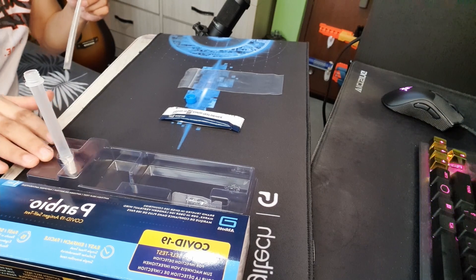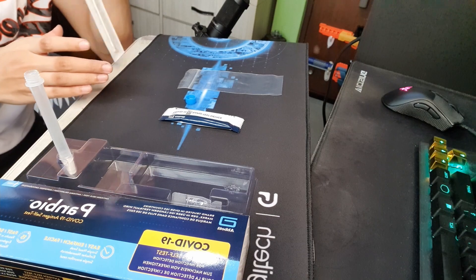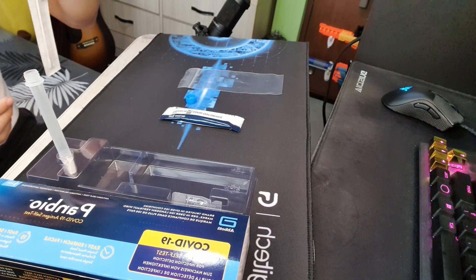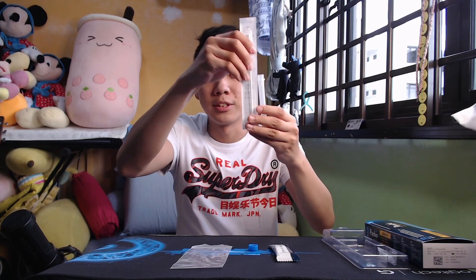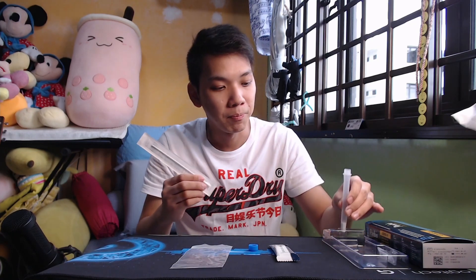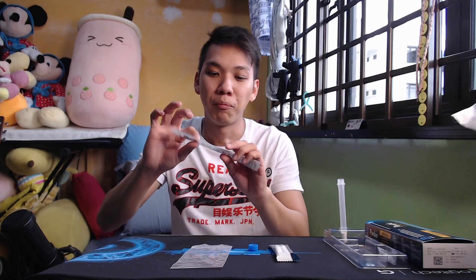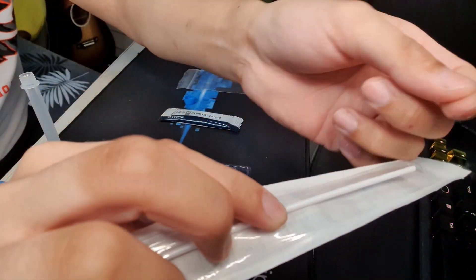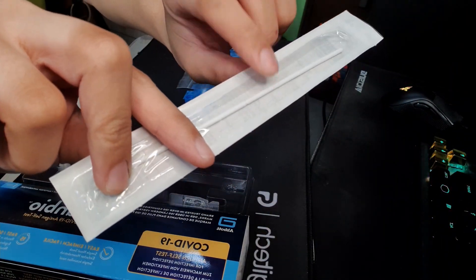Once that is done, step five: insert the swab into the test tube. Make sure it's inside the liquid and stir it like you're stirring coffee — at least five times, the magic number for this test. After that, you want to get rid of most of the liquid inside the cotton bud by squeezing the bottle against the swab so it's not dripping. After that, you'll see the break line — break the swab at that line and discard the top part, leaving the remaining swab inside the tube.